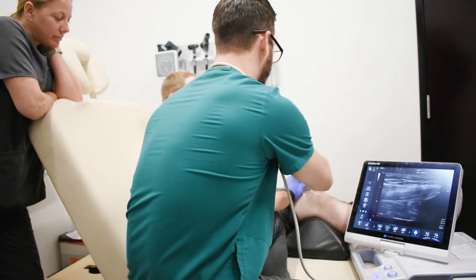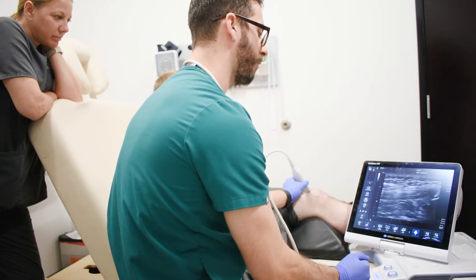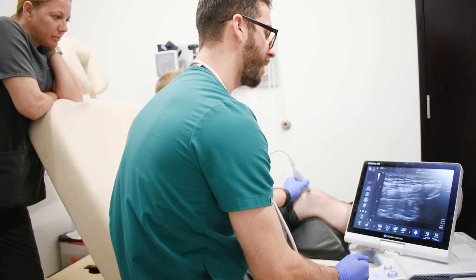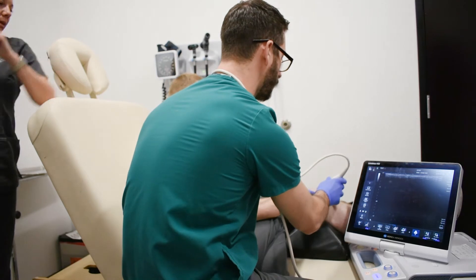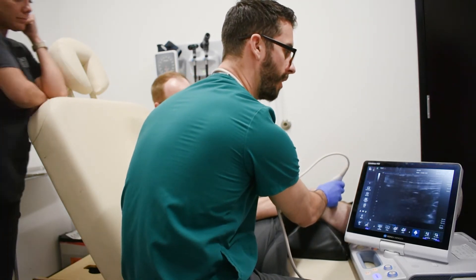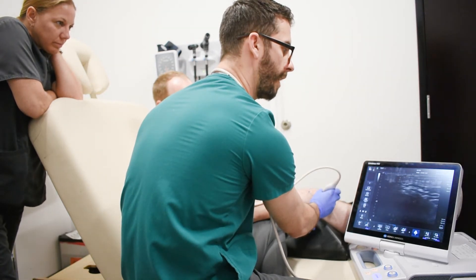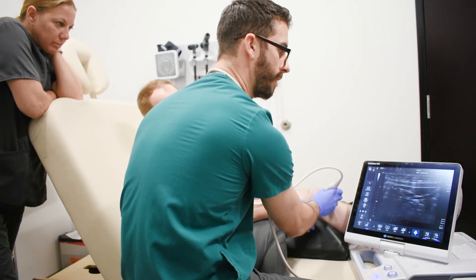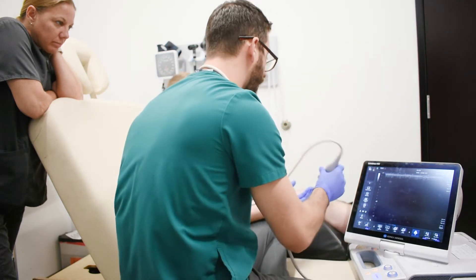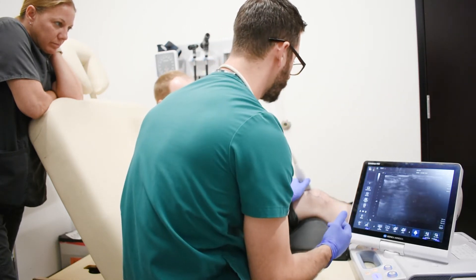With scanning the knee joint, the first thing you want to find if you're going to go intra-articular — we go intra-articular from a superior approach. The reason why is because you can't actually see the intra-articular space from when you go through the sides of the knee. You can see cartilage there, but you can't actually see the intra-articular space, so you can't technically confirm that you're in intra-articular space. Whereas from the suprapatellar recess, you can.